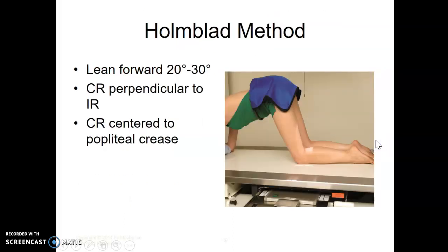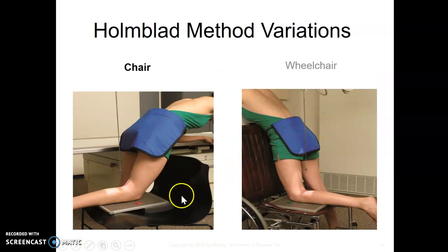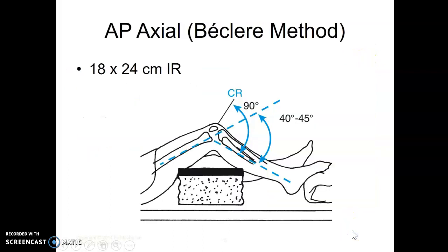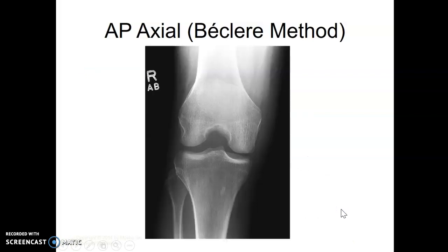The Holmblad method is another version of the tunnel view. The patient is on their knees, leaning forward 20 to 30 degrees. You can do it in a chair or a wheelchair. And this AP axial method, I believe, is the Béclère method. So if you need to do a tunnel view but the patient can't go prone, it'll be AP, the cassette supported, knee flexed 40 to 45 degrees, same centering, CR perpendicular to the lower leg. That is the Béclère. Here's the Béclère method. You can see it looks like a tunnel in here.